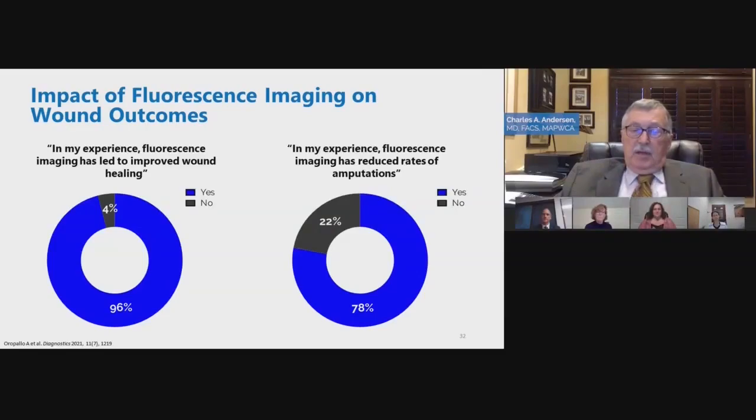With the ability to look at those wounds and identify bacteria at 10 to the 4th before it becomes clinically evident, and do the appropriate debridement or appropriate dressings, then you stop the progression of that infection. And I think stopping that progression, avoiding the significant foot infection.